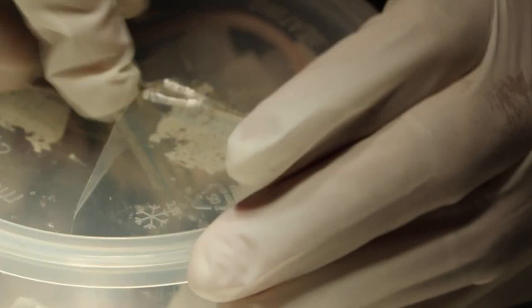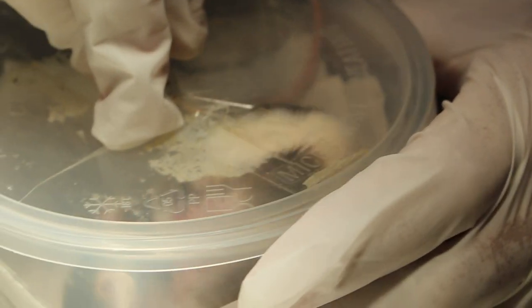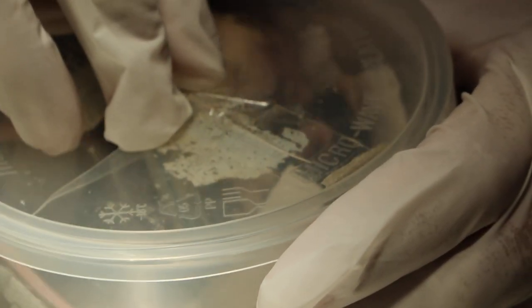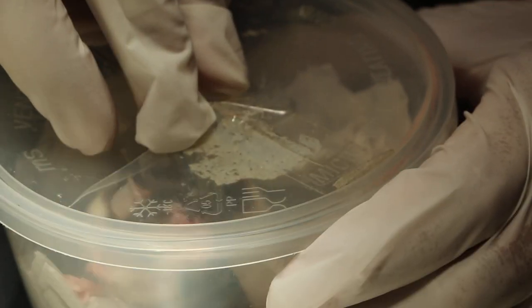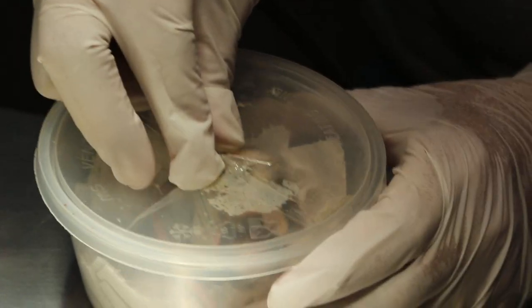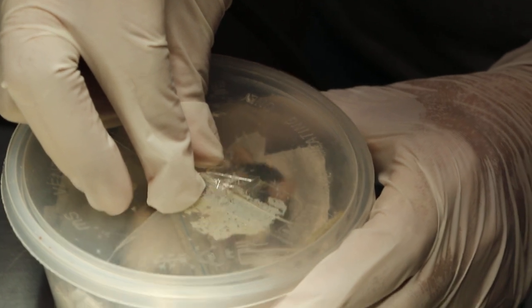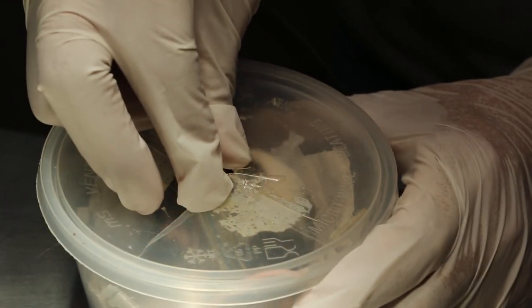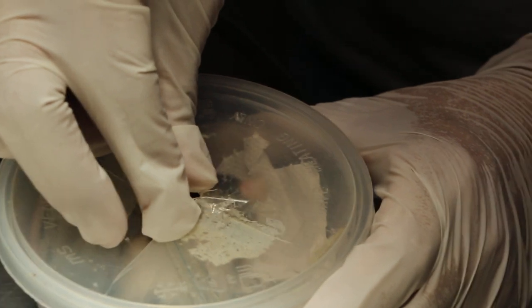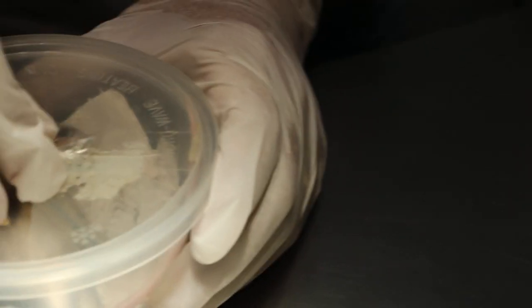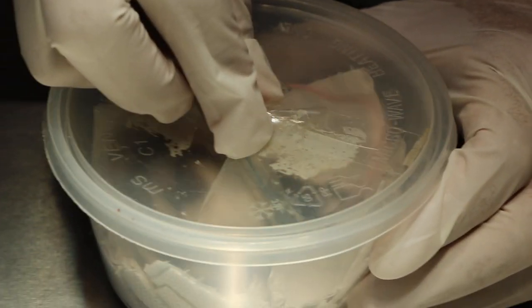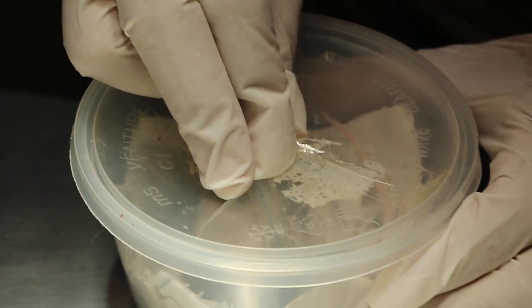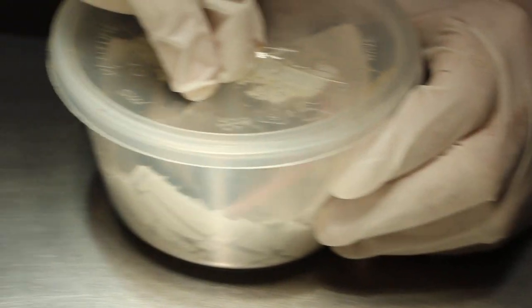Now we cover up. This one is a bit too big. Next time better put more tissues there, otherwise it will take forever. This is the size of this mouse - too much of the dead space. Dead space means the area between the mouse and the tissue. Too much area so the gas will take a long time to go in.